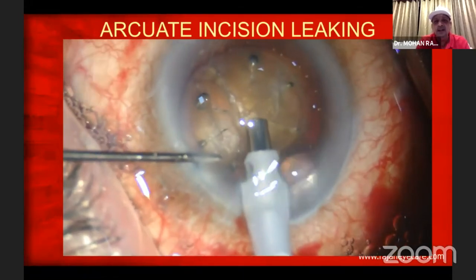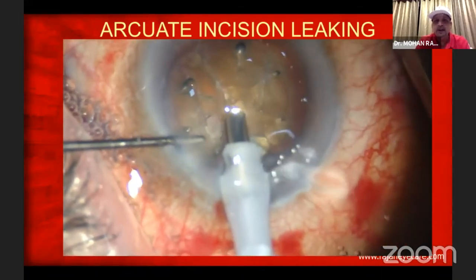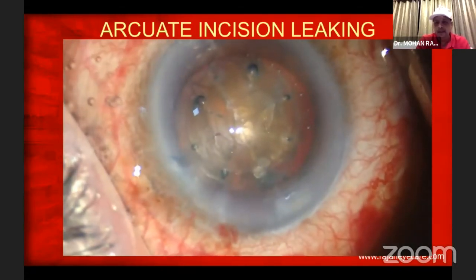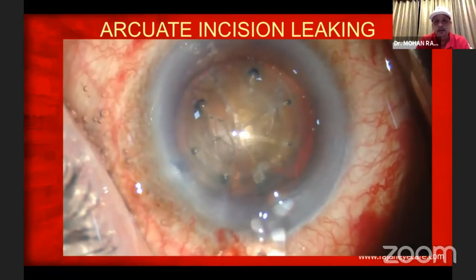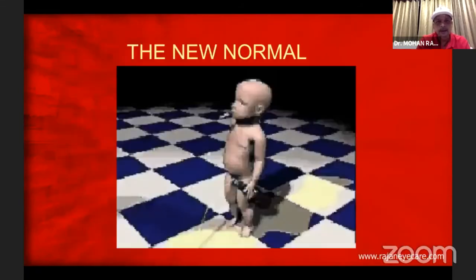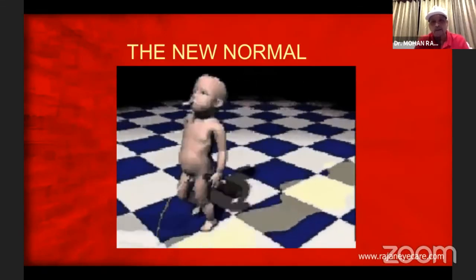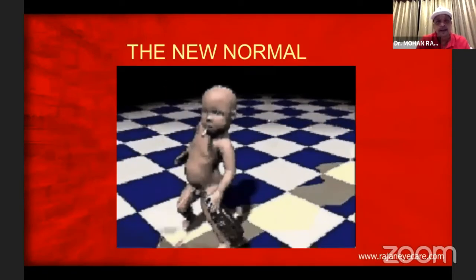I did a femto after four months, and you can see this: the arcuate incision is leaking because I used a new nomogram. After three or four months, when I start using a femto with a new nomogram, this will happen. This is the new normal, which is now becoming very common with all of us. Thank you very much.